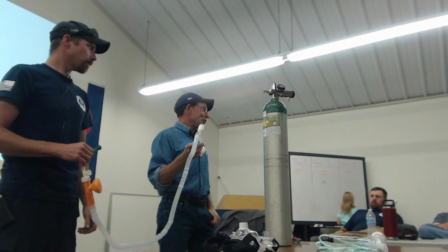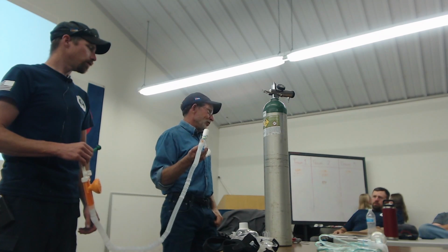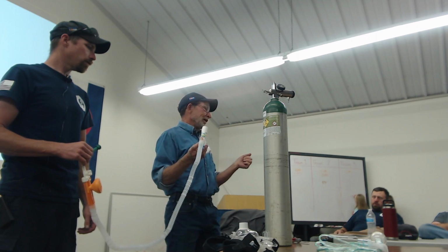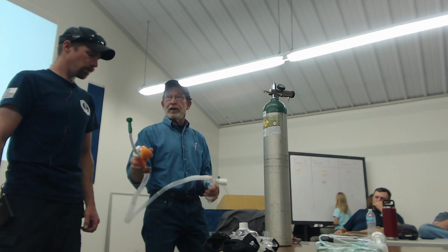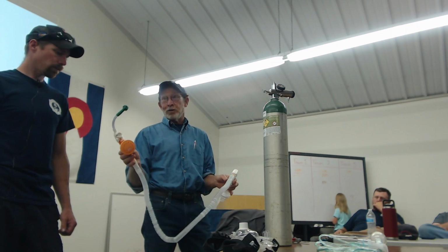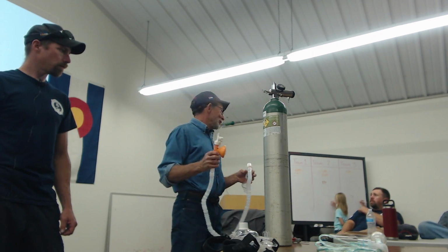And now, since it's not working, you're going to take them off of that 90% and put them back on 30%. That's not a mistake. That speaks to the value of positive pressure support on the airway. So yes, you're taking them from the 15-liter non-rebreather, which may be giving close to 90%, give or take a few percent, and putting them to the preset rate of 30% for starters, because that's what our protocol says to do. That's not a mistake, and they generally will not crash.